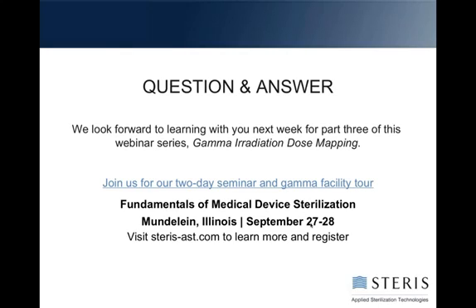Right. Can you use biological indicators for product sterility testing? If so, are you allowed positives? Well, in the standards for radiation, it is said that it is not recommended to use biological indicators for radiation. The main reason is that they don't accurately represent it. They're one organism with a not exceptionally high D-value, or the dose at which they would be dropping a log in population. They are also biological, so they can be variable.